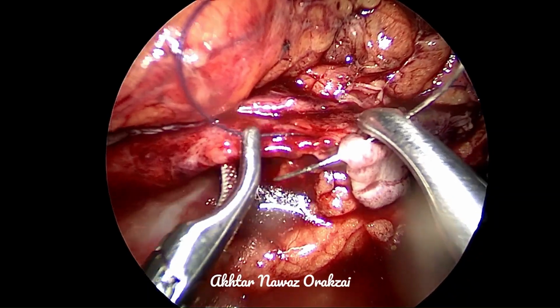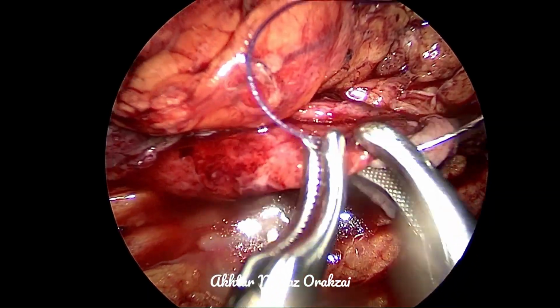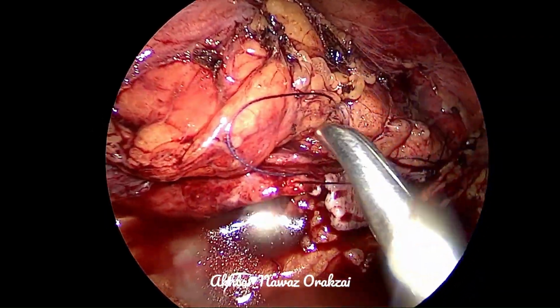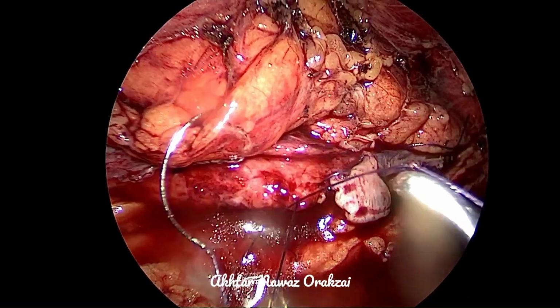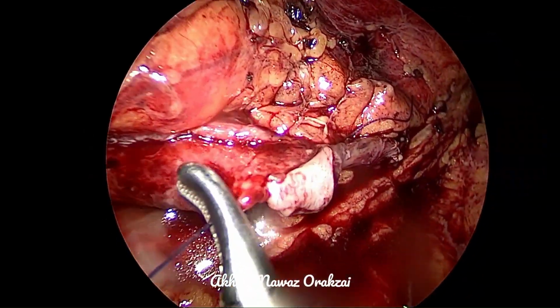Dependent anastomosis is going to decide the fate. Then the anastomosis should be without tension. This is the third principle. The fourth one is the watertight anastomosis.